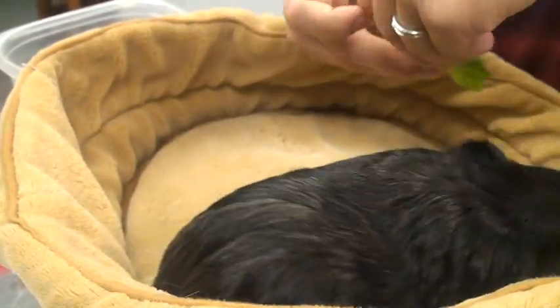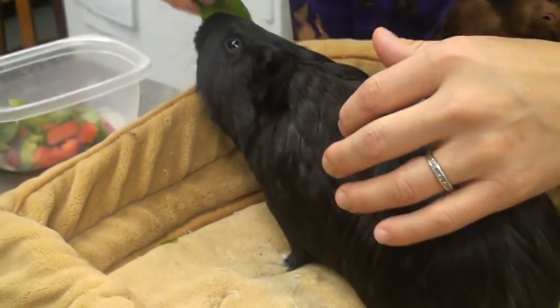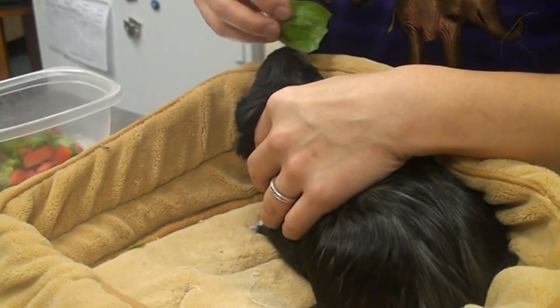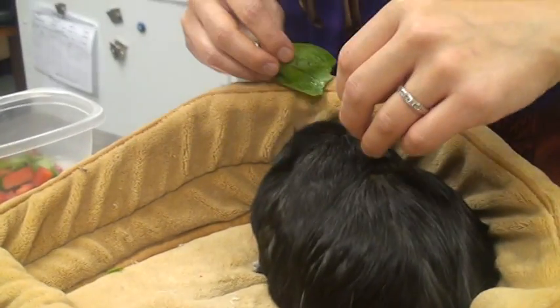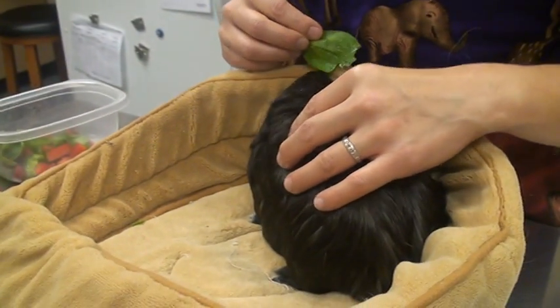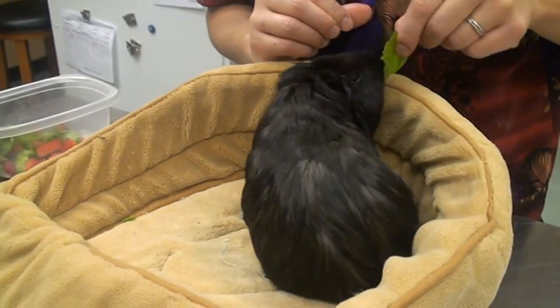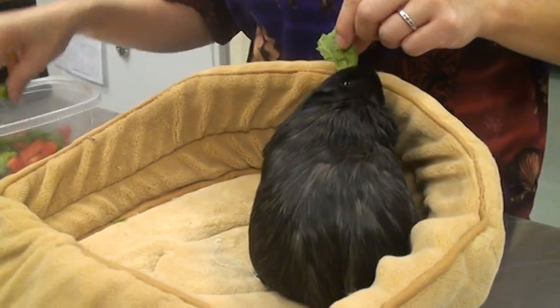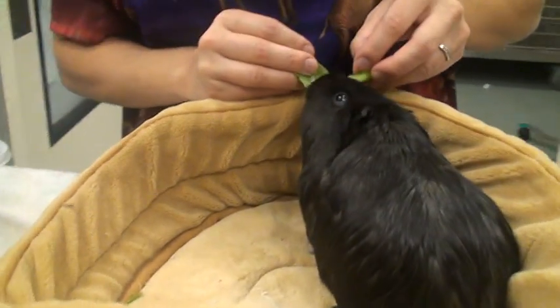Let's see how we're going to do this. Using an apparatus to kind of support her head. There we go — we want to encourage the upright position. And this could be done through food and turning. Sometimes a more rigid piece of fruit works really well.